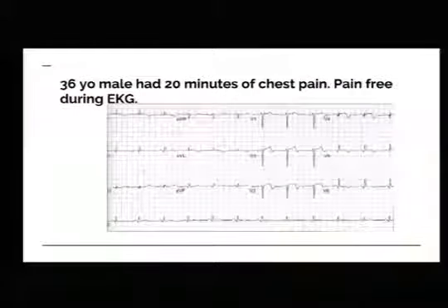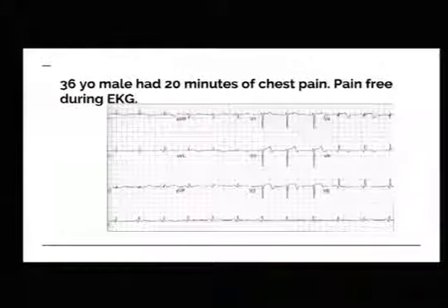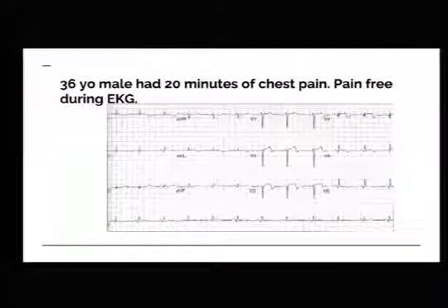Okay, 36-year-old male. He had 20 minutes of chest pain, called 911 when he was having the severe chest pain. By the time you get there, get him hooked up to the monitor, he is pain-free. What do you see?